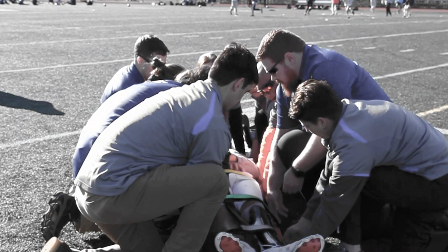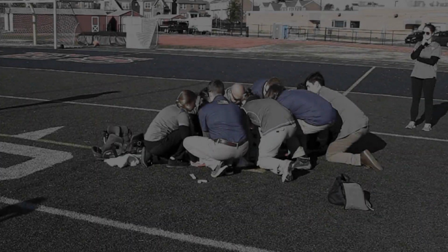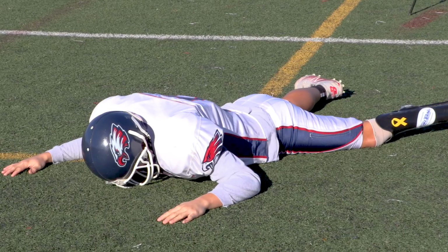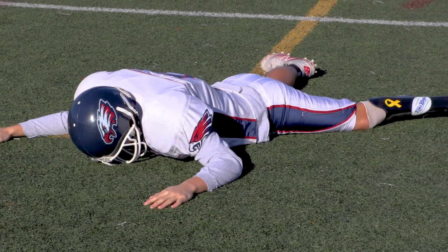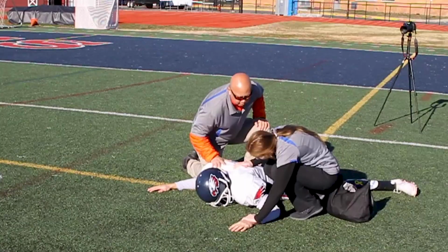Many EMS teams have reduced the use of spine boards in those injured in motor vehicle accidents and other trauma. However, in athletics, the recommendation is to place the athlete on a spine board for transfer to definitive care. If the athlete is found in a prone position, whether conscious or unresponsive, it is imperative that the athlete be repositioned supine to have immediate access to the airway and chest.